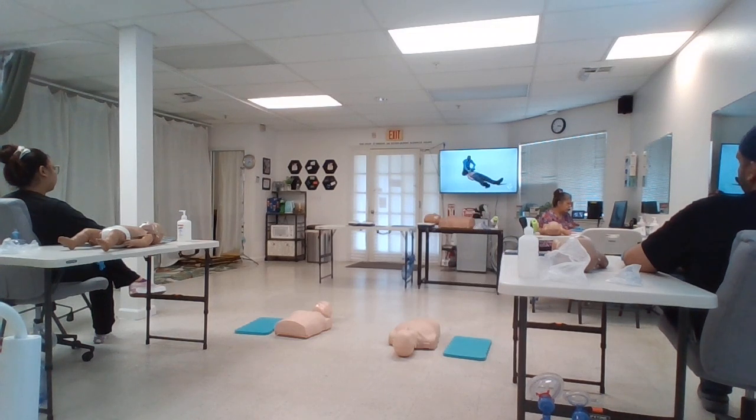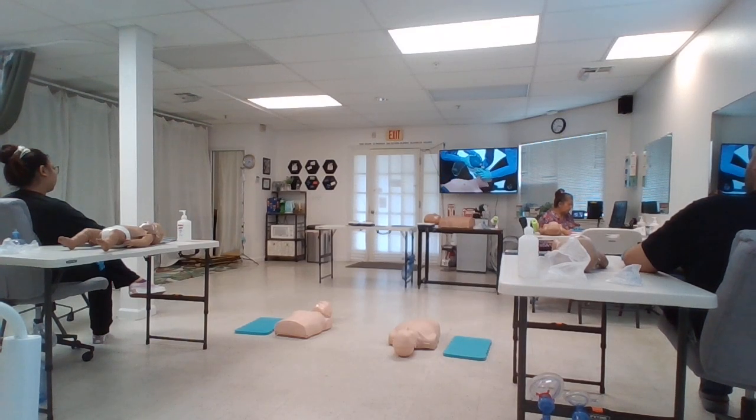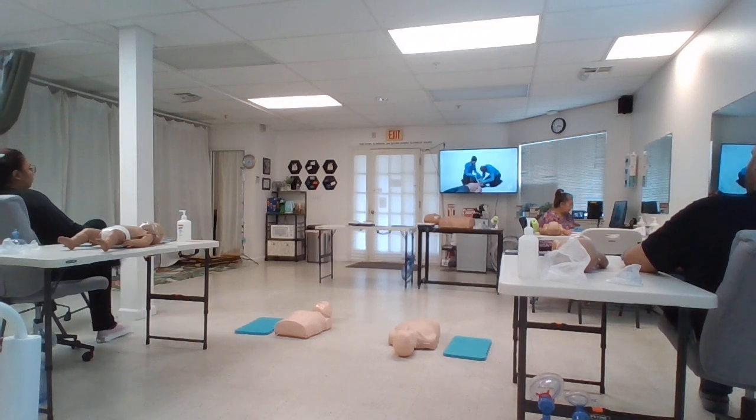Delivering breaths in this way will reduce the chance of gastric inflation, or air going into the person's stomach instead of the lungs. Gastric inflation can cause vomiting, possible aspiration. If you have multiple rescuers, the most effective way to deliver breaths with the bag mask device is to use the two-person technique. One rescuer focuses on keeping the airway open and securing the mask, while a second rescuer squeezes the bag to deliver breaths, just enough to cause the chest to rise.